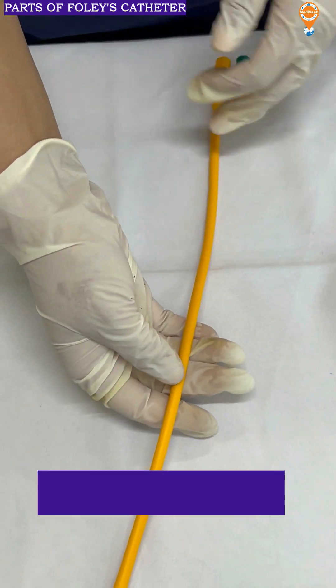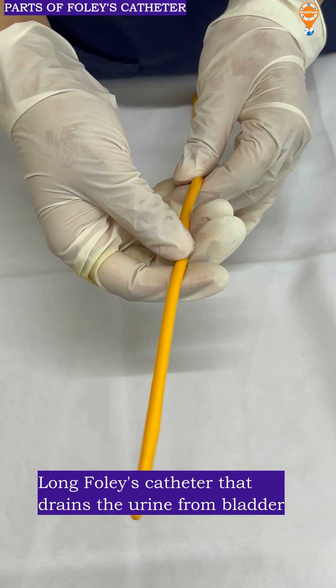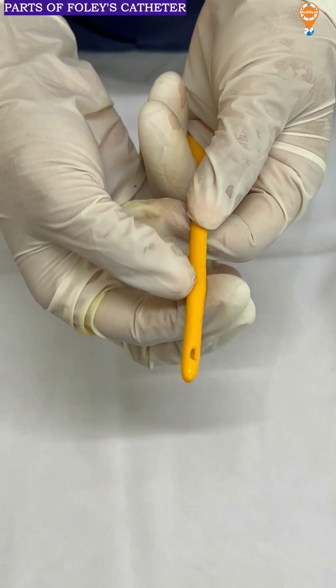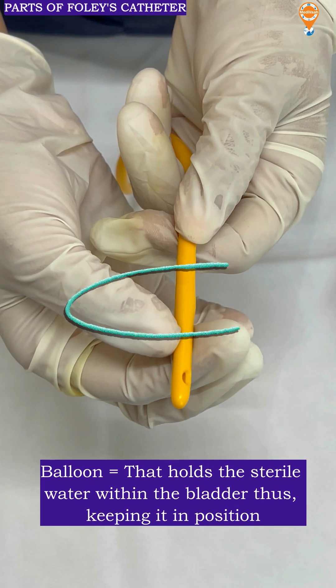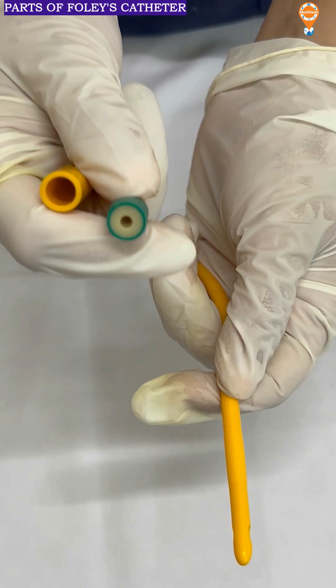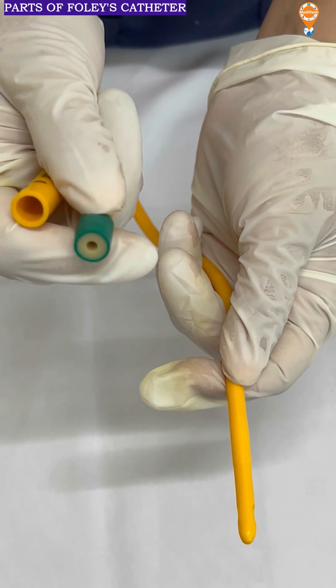This is a Foley's catheter. According to the size of the urethra, the catheter is being inserted. Here a small bulge is there — which we will be showing in our upcoming videos — where there is a balloon present. This balloon inflates as we push in 10 cc of sterile water inside.